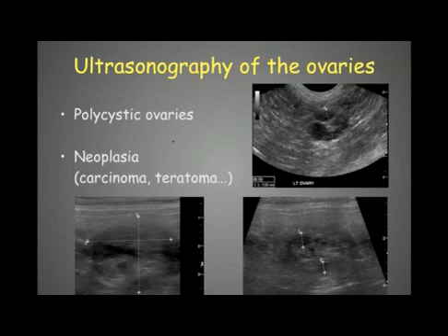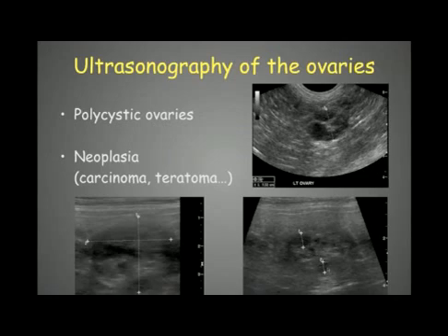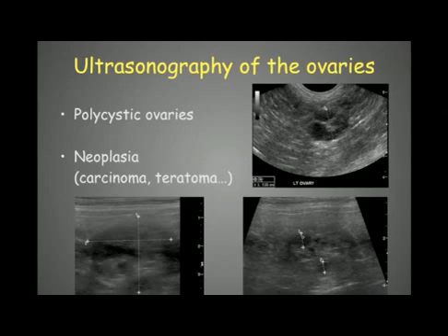We can also see neoplasia, such as carcinoma or teratomas. Here we have an example of a neoplasia with the ovary measuring two to three centimeters — that's definitely too big. It's an isoechoic mass with some hypoechoic cavities measuring around six to seven millimeters in this case. That's quite typical of neoplasia, because an ovary with a simple cyst would be much more anechoic. The hypoechoic area here is a necrotic region secondary to the neoplasia.